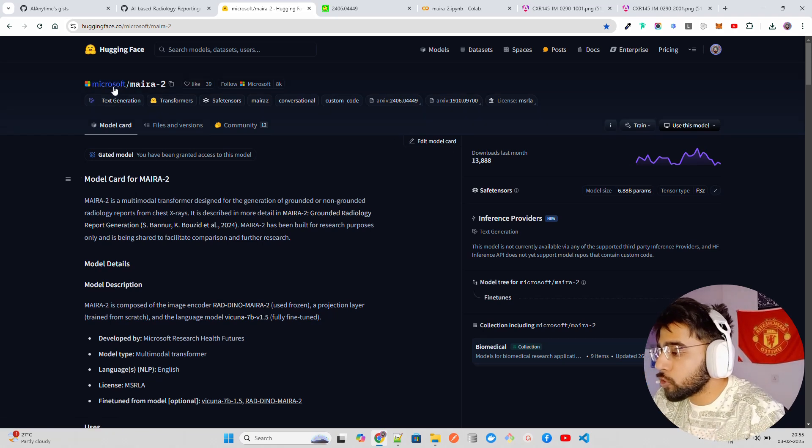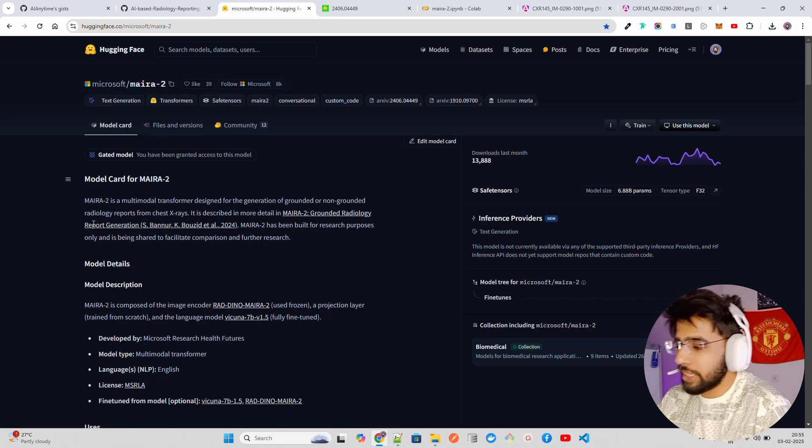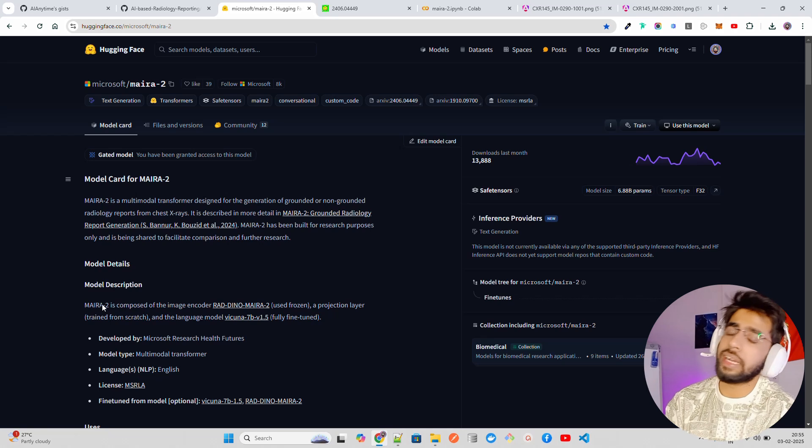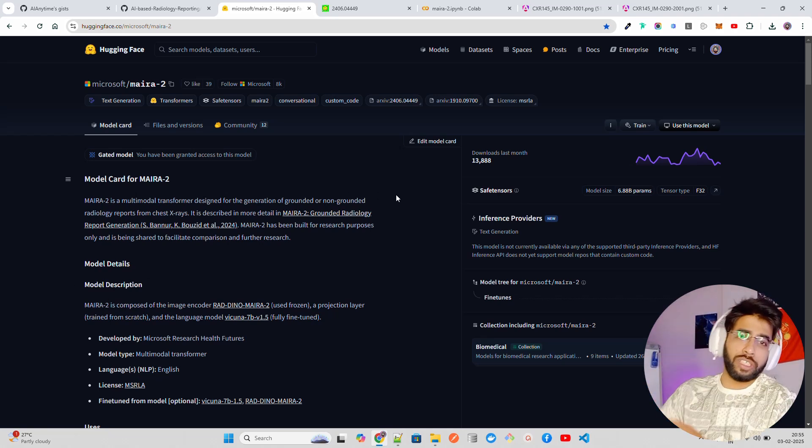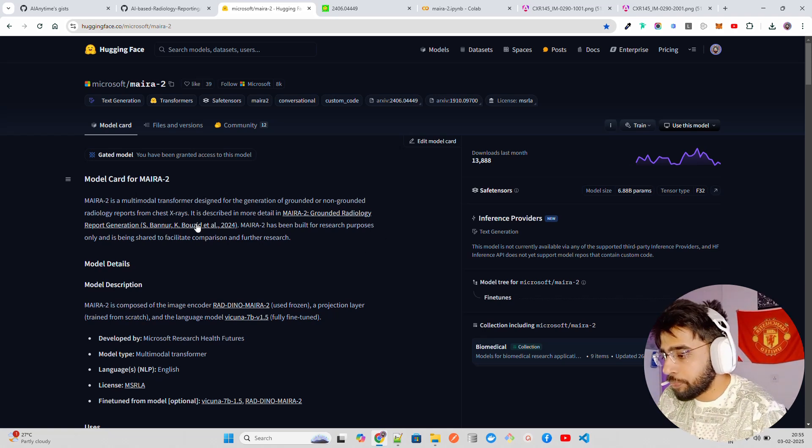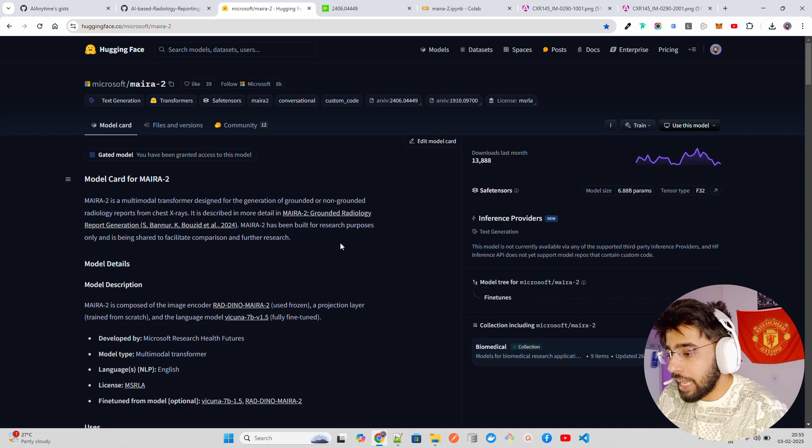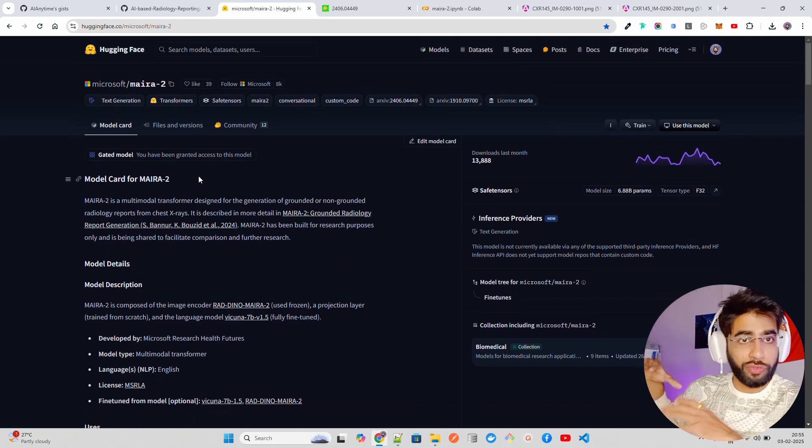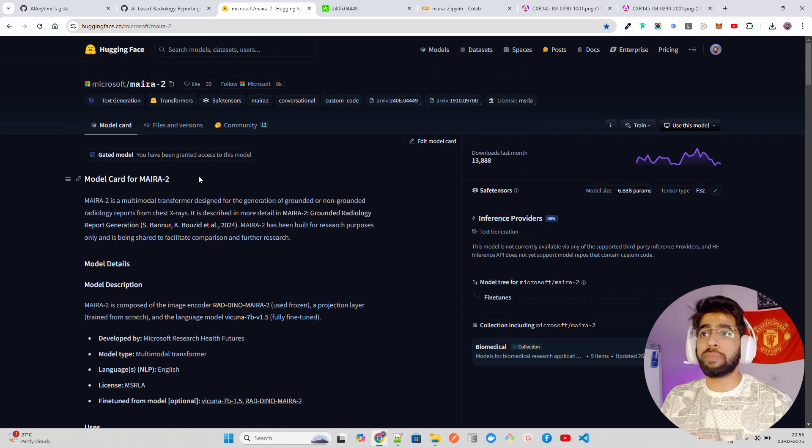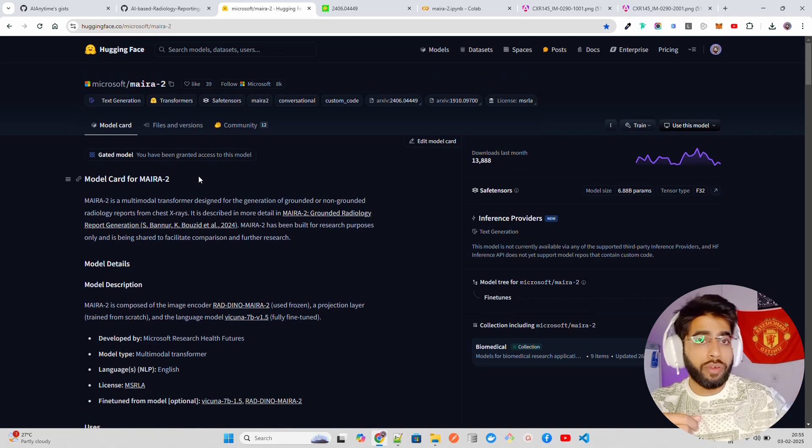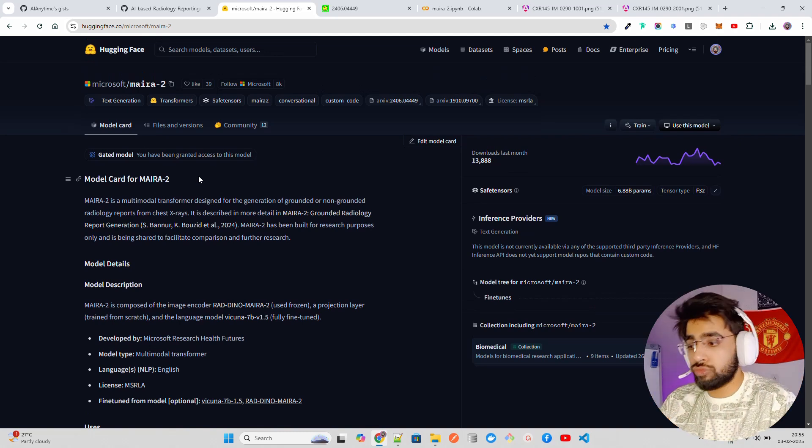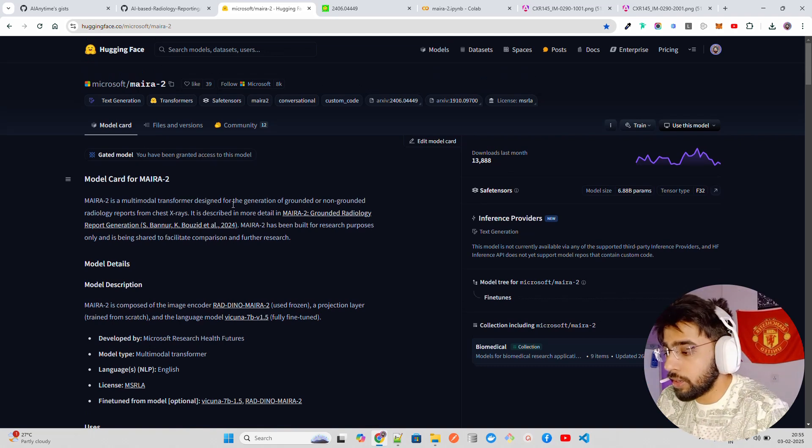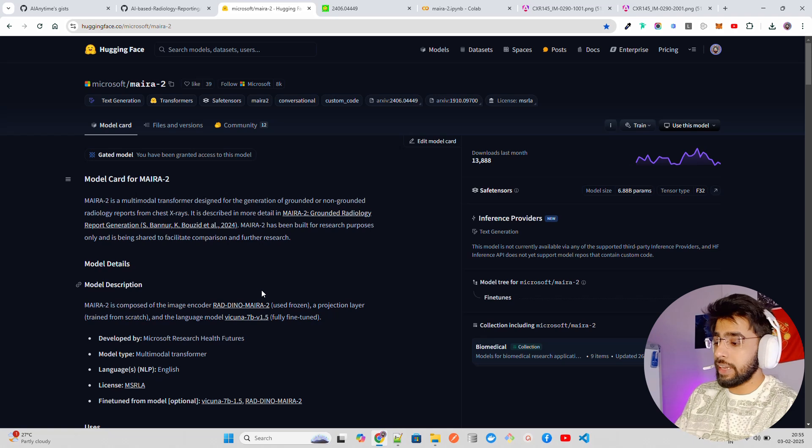If you look at here on my screen, I am currently on a Hugging Face page of Microsoft MAIRA-2. It says a multimodal transformer designed for generation of grounded or non-grounded radiology reports from chest X-rays. This is not the first model in this family - it's built on previous models like MAIRA-1 and there was a model called LAVA that has used multimodal data to perform different tasks.